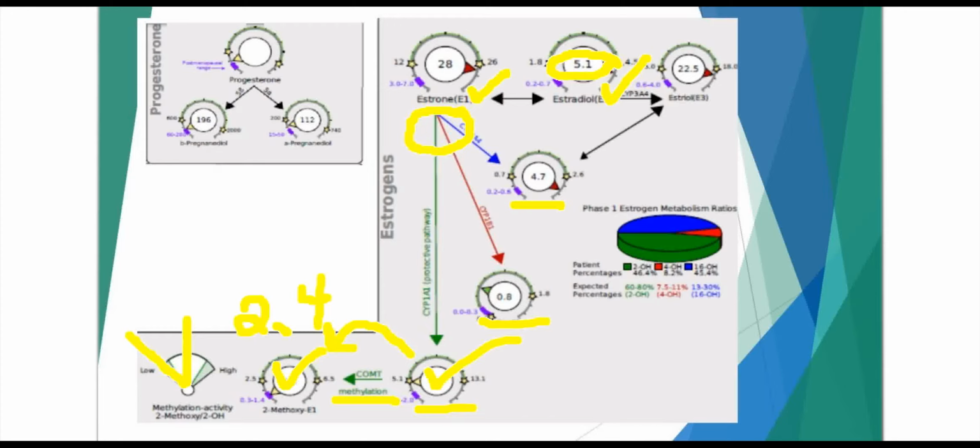You can see progesterone. So progesterone is unique in that it's not in urine, not as progesterone. It has to get turned into these metabolites first. So we have alpha pregnanediol and beta pregnanediol. These represent the 2 main pathways that progesterone goes down. And when we correlate those numbers to serum progesterone or blood progesterone levels, we get a really nice correlation. So what we're doing is we're measuring these two, and you can see they're a little higher than a postmenopausal woman, but a little bit lower than a premenopausal woman. The value then up here represents a weighted average of those two. So it's halfway in between those two.